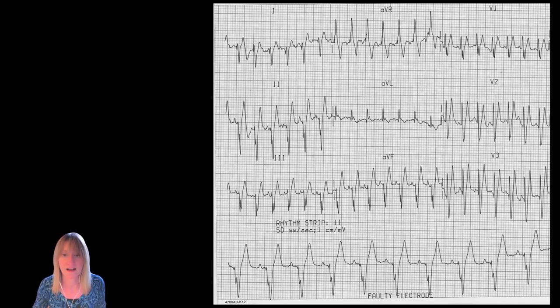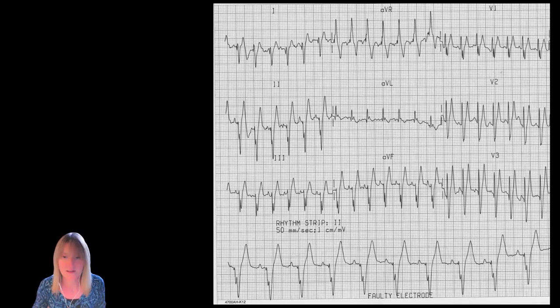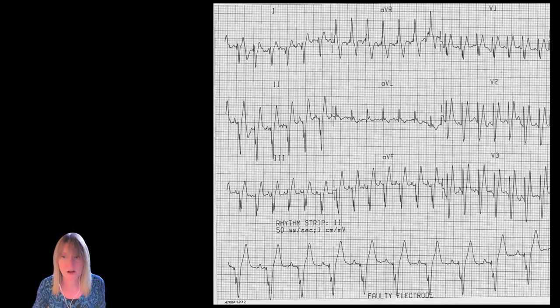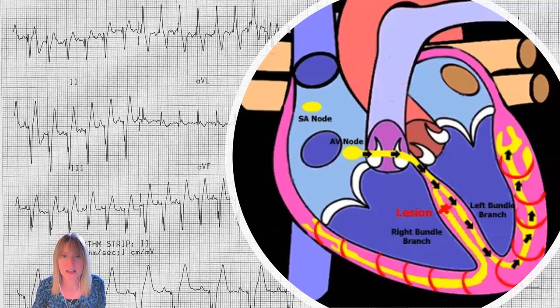But importantly, I have P waves in front of every single one of those at a consistent distance. There is AV association. And so I am not falling for the trap that this is a ventricular rhythm of any kind — it is still a supraventricular rhythm, albeit with a conduction abnormality. So I'm thinking bundle branch block. How do we figure out which it is? I'm going to think about mean electrical axis and how things might proceed down these bundle branches.